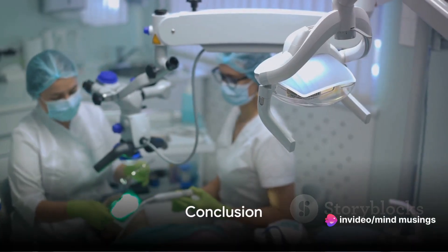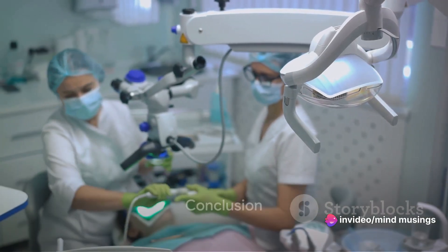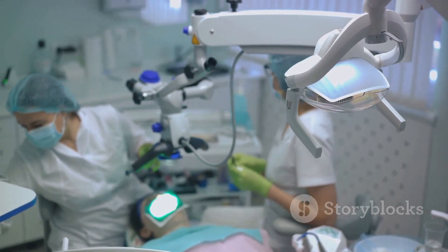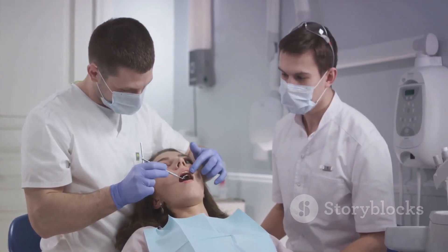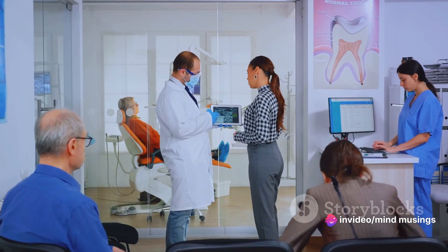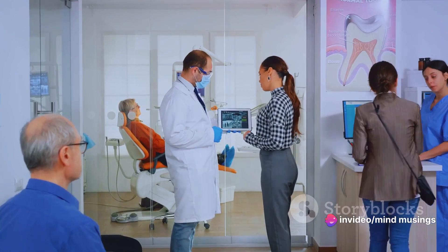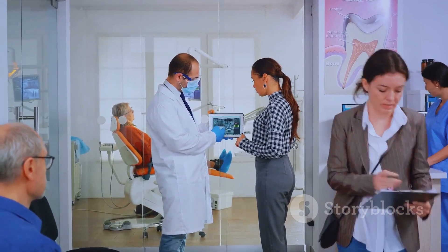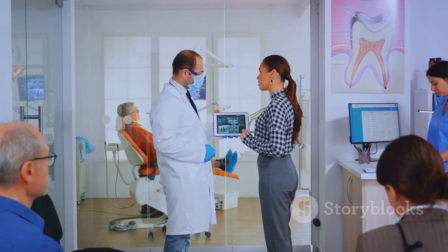To summarize, an intraoral camera is a revolutionary tool in dentistry that provides a magnified view of the mouth in real time. It works using LED lights and a tiny camera, transmitting the images to a computer for display. This technology not only aids in accurate diagnosis and treatment, but also educates patients, enabling them to take an active role in their oral health.